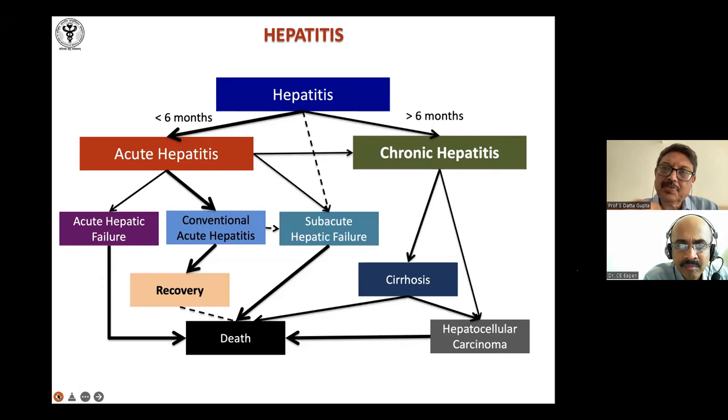So if you find this diastase PAS-positive material in the Kupffer cells and in the portal tract, you know there has been a recent episode of hepatocyte necrosis, which you may not see otherwise. The other thing, though it's not required now, is that traditionally in the UK they always tried to screen for alpha-1 antitrypsin deficiency as one of the causes of chronic hepatitis. This is one easy way of detecting it.